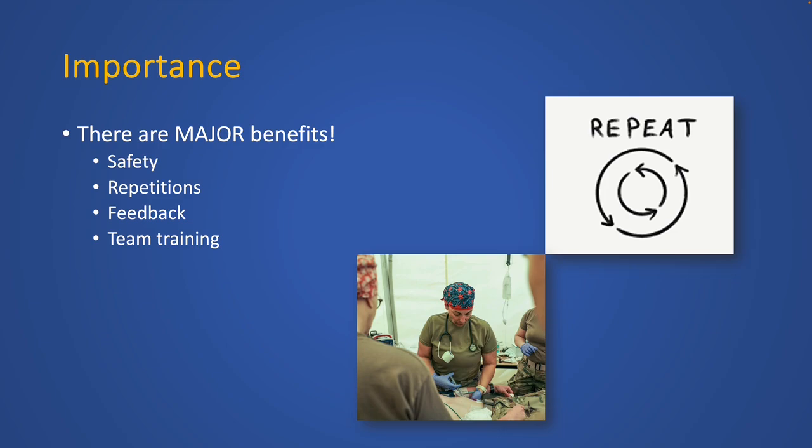So this technology is clearly important and there are some major benefits. The first benefit is safety. Simulators offer the clinician a risk-free environment that allows them to practice a skill without any potential patient harm. That's a win for all of us.